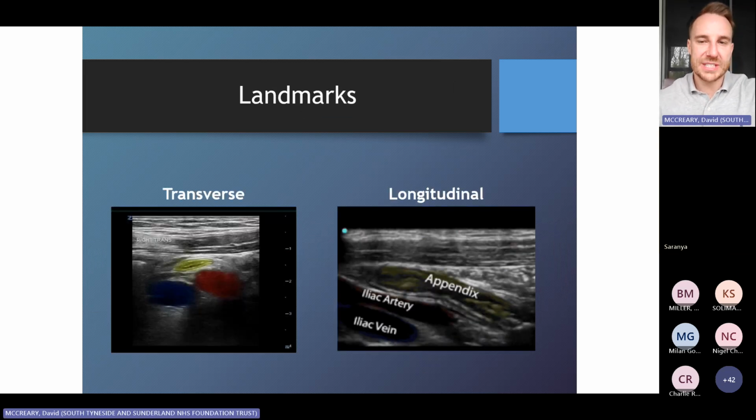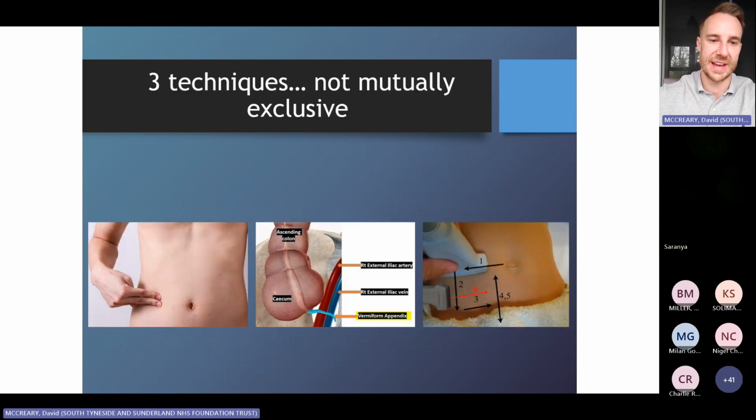So when we're talking about the iliacs, we're obviously scanning down. So we've got near field is obviously anterior to posterior. If the probe is in transverse, we're going to be cutting through and seeing our vessels also in a transverse section. So seeing them as a circle, which I always like to talk trainees through as cutting through like a CT scan, seeing a circle. If we then rotate into longitudinal, we've got the probe marker there. So we rotate our probe that way, and the top of the probe to the patient's head is always the convention. We're going to see our vessels in a tubular manner like this, running downwards. And in all cases, the appendix is thought to sit within this region, as per this previous diagram. We're going to go through that in a bit more detail sonographically.